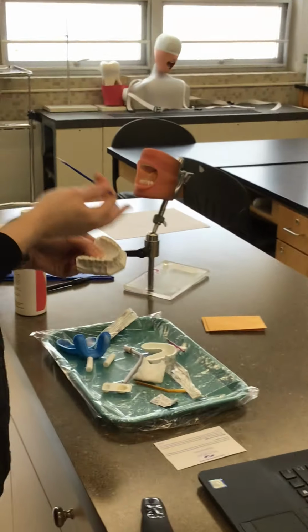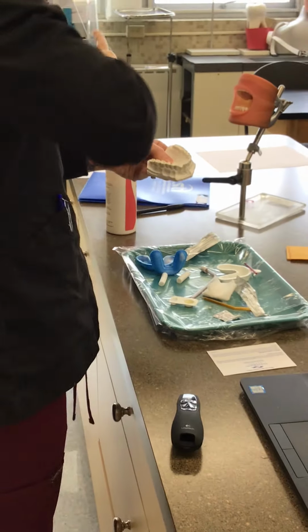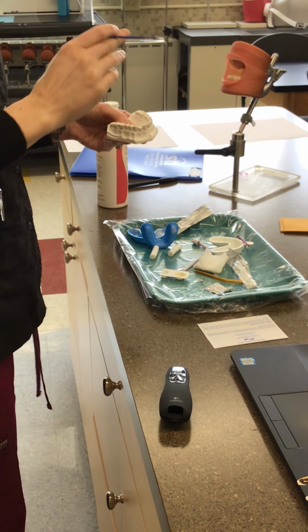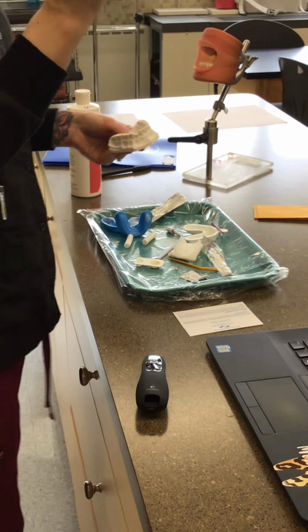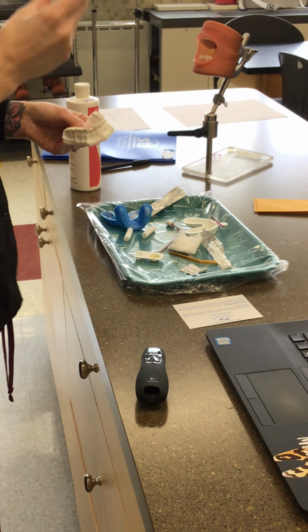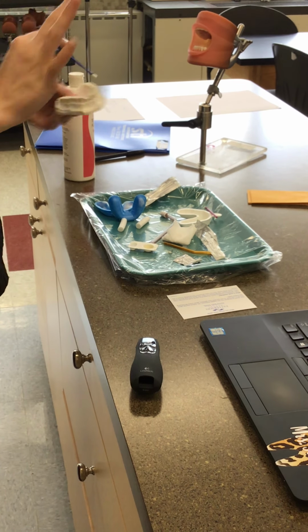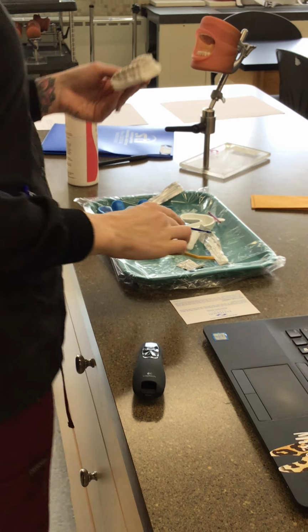Once it comes in contact with the tongue or the tissues or just saliva, it becomes less sticky. It almost is like a dried super glue. Otherwise, it's really sticky, so if it gets on their lips, they're gonna keep sticking together and they're gonna hate it, so be mindful of them, okay? Just try not to get it everywhere and anywhere. Like I have it on my fingers now because I didn't wear gloves and I can feel that it's sticky.